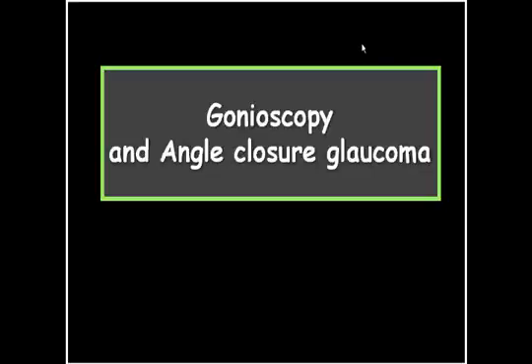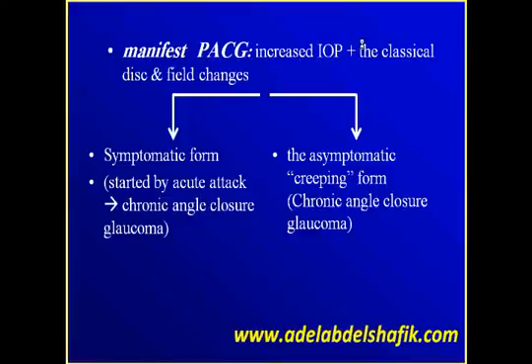Now, gonioscopy in cases of angle closure glaucoma. We all know, we're accustomed to know, that acute attack of glaucoma is painful, and we do gonioscopy to see if the angle is totally occluded all over or still functioning.